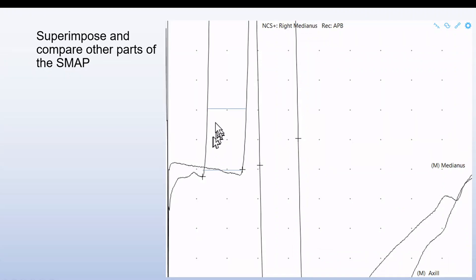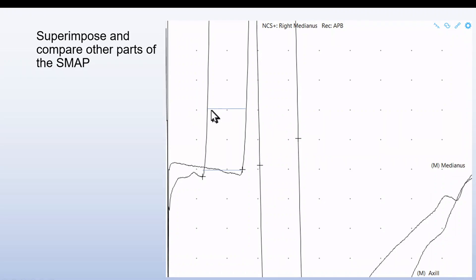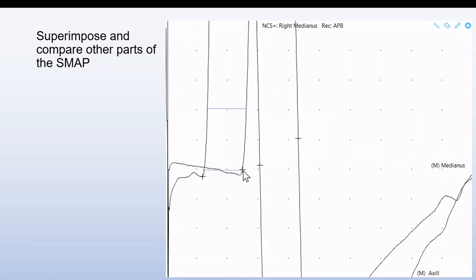A good rule is to measure on symmetric points of the signal, for example half a millivolt up in the negative direction or even the peak. Then we get the latency from here and can calculate the velocity. If we move this line down here and we have a correct distal setting, we can see where the optimal setting is for the proximal situation. The conduction velocity can be calculated from this time interval.